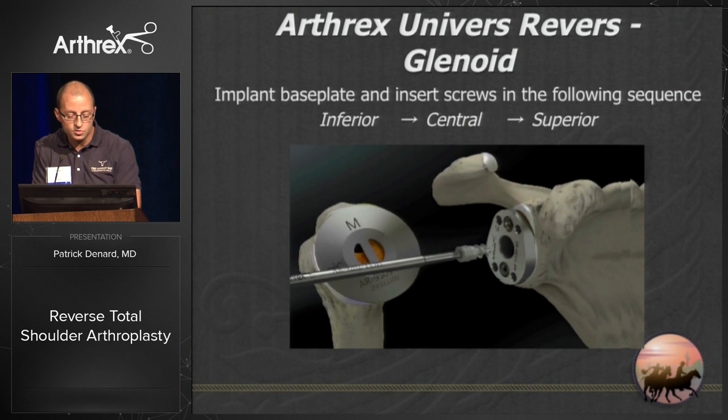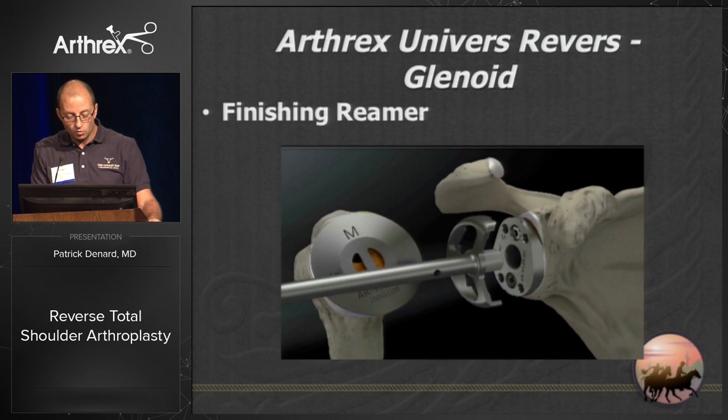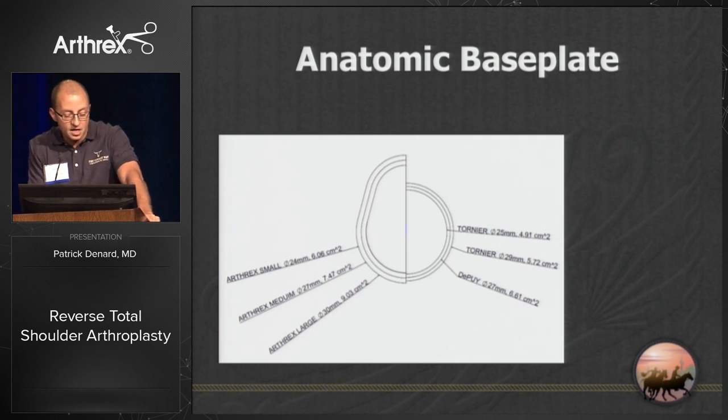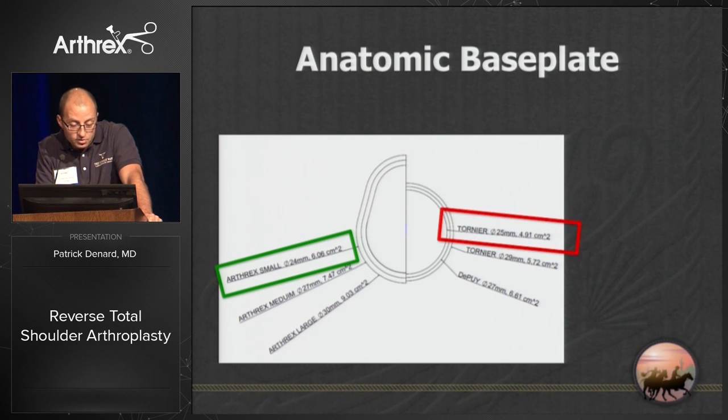Place your screws moving from inferior to central to superior. I like to put the inferior screw almost all the way down but not quite lock it, so I can get compression from the central screw, then lock the inferior screw and place the superior screw. I aim the superior screw anterior and superior to hit the base of the coracoid, and the inferior screw inferior and slightly posterior — divergent in both the coronal and sagittal planes. Ream over the top of the base plate to accommodate the glenosphere with no impingement.